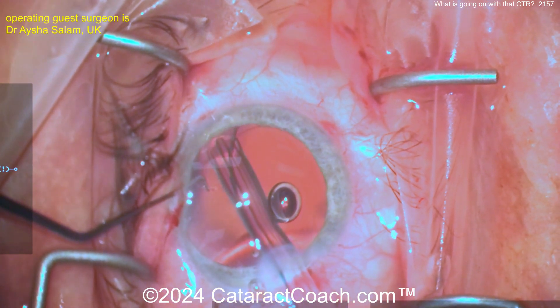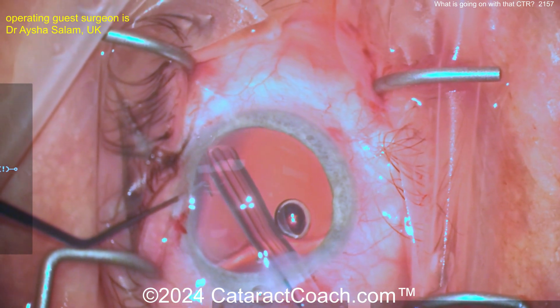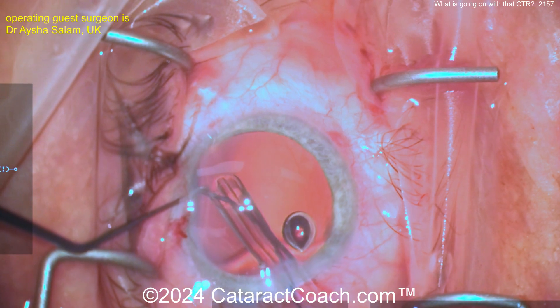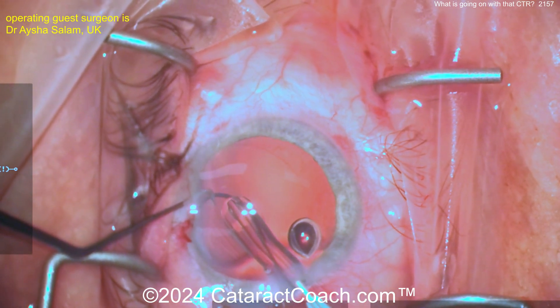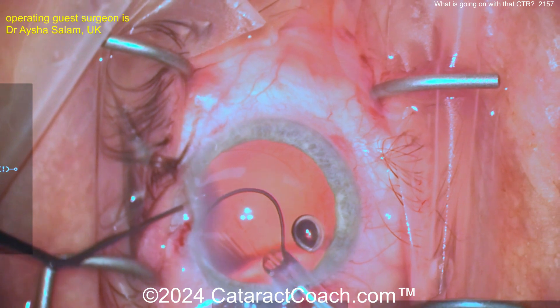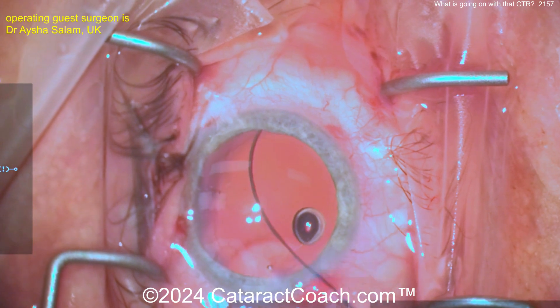I want to thank our guest surgeon for sending this video in — I think we can all learn together from this, and we've all had challenges with CTRs. But again, here it goes curving the other way because it's not advancing in the capsular bag. You can damage the capsular bag, damage delicate ocular tissues, scrape this against the endothelium, or cause zonular breakage.